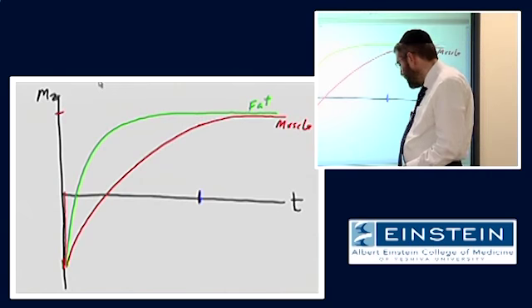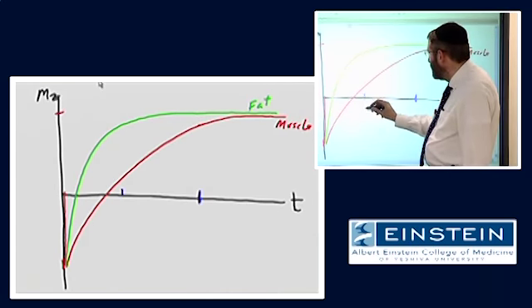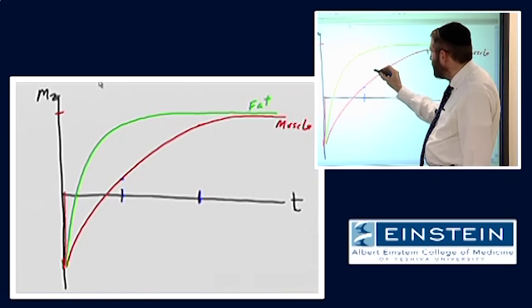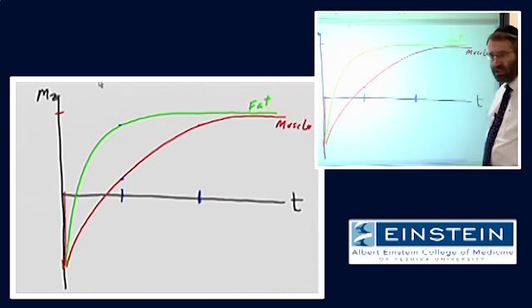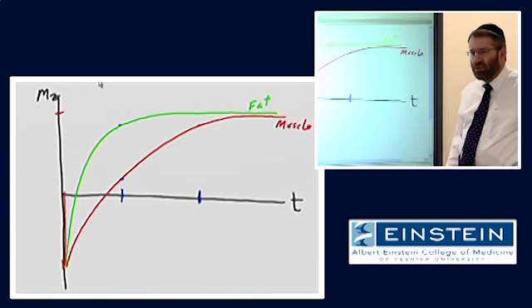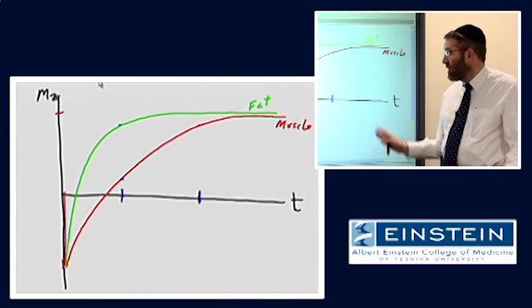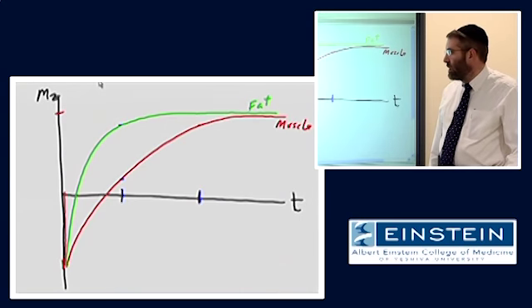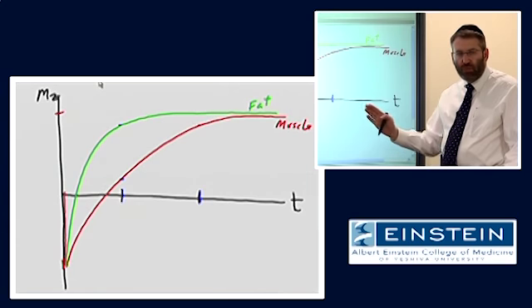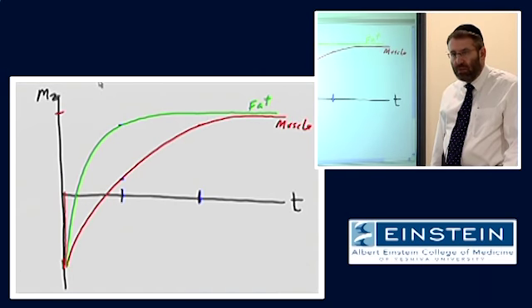If we change the location of our 90, we can generate much greater amounts of contrast between those two tissues. That contrast is a function of what? The T1 of the tissue. So the second thing we can say about this approach is that it gives us a new way to confer contrast that's based on differences in T1, or to make an image appear more T1 weighted, so to speak.